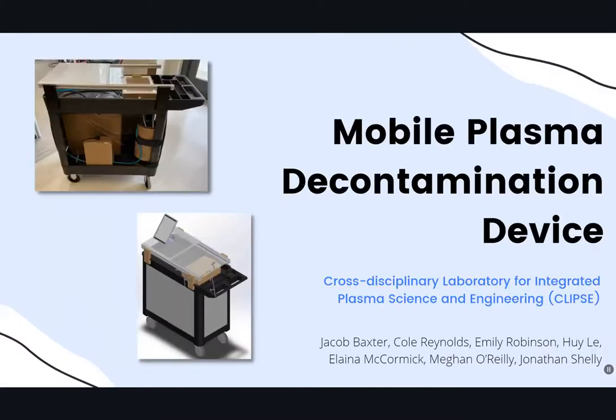sterilization. Our team was paired with Penn State Cross-Disciplinary Laboratory for Integrated Plasma Science and Engineering and tasked with creating the housing for a plasma decontamination device. This device needs to be safe, mobile, and user-friendly. Our design went through a few iterations on its size and the drawer mechanism, but our final design consisted of a cart with a sliding lid door and plasma decontamination box inside.